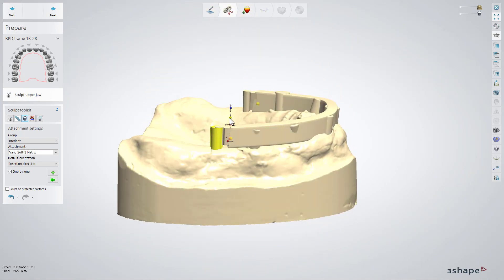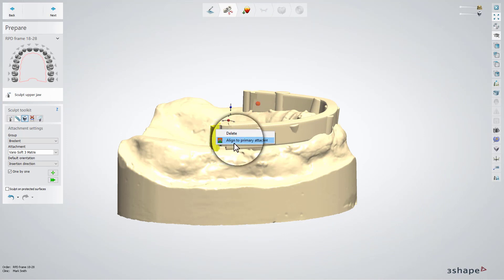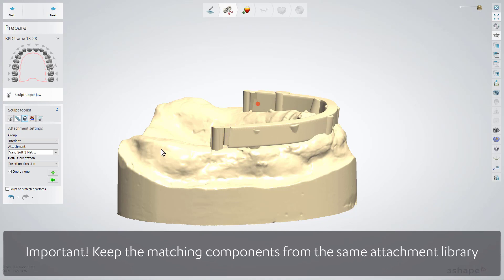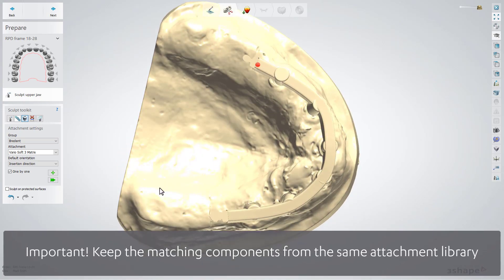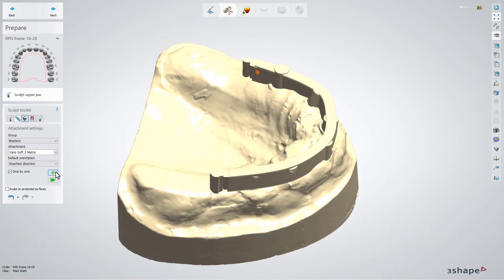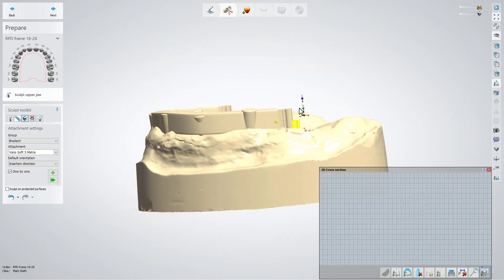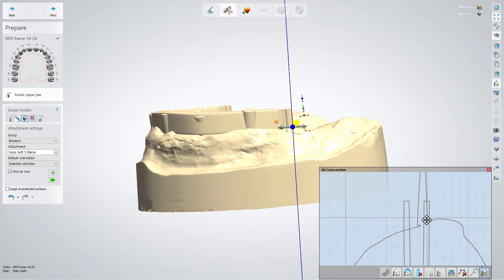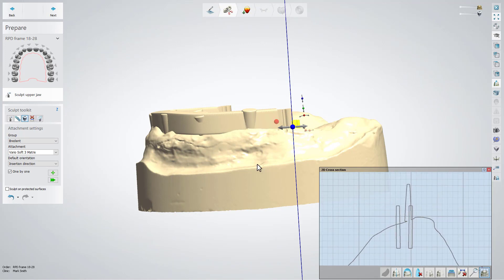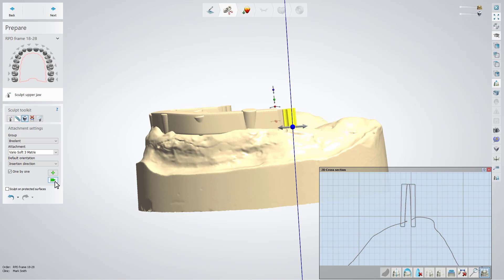After that, right-click on the Added Attachment and choose the Align to Primary Attachment option. This allows you to place the female part according to the male part. You can also place it in a random position, close to where the male part is, without focusing on doing it precisely, and then use the Align to Primary Attachment option. The system will combine the two parts.